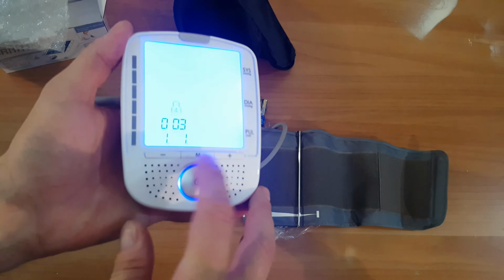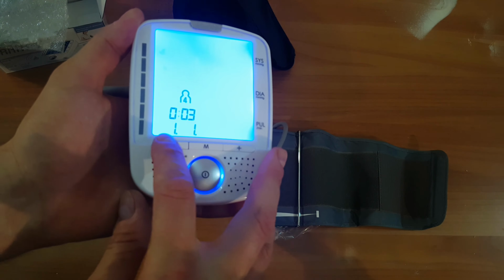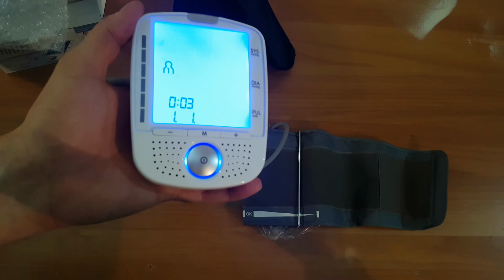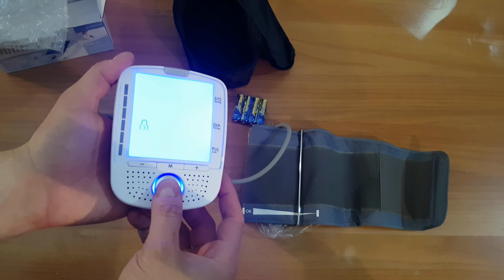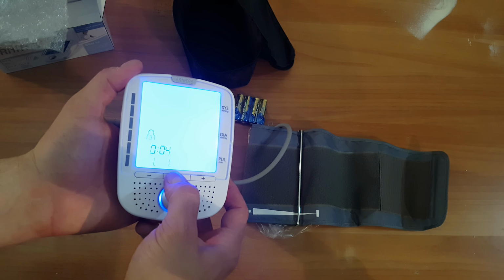Okay, this is the function button. Minus and positive memory. Yep, let's change it to English. Okay, changing the time. Press the on off button for 5 seconds, then we can press the M button.